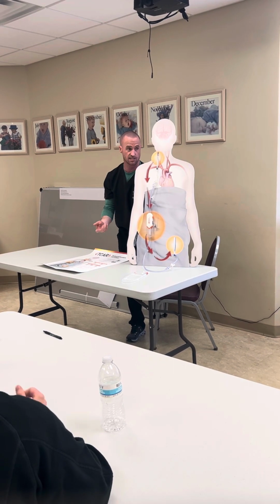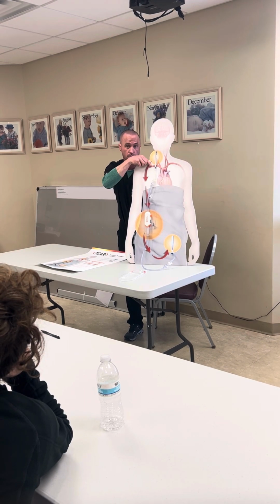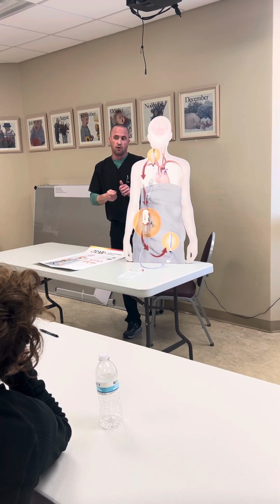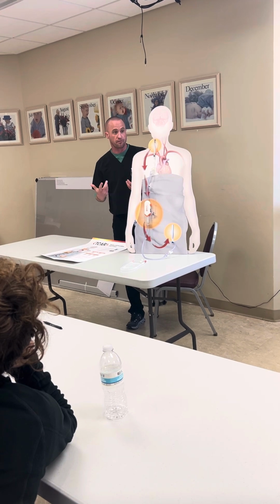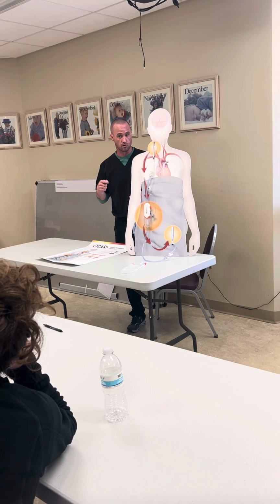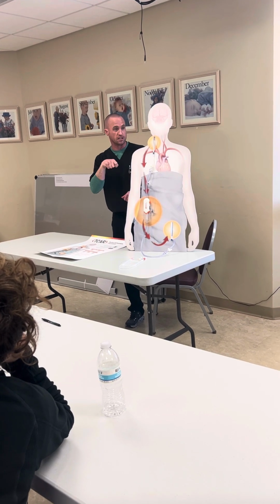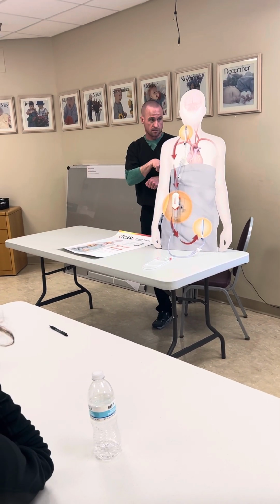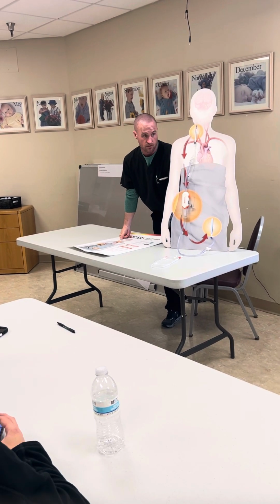So access, in my opinion, is the hardest part of this. Truthfully, it's getting that sheath in the carotid. Some people like to come in real steep. Some people don't have great counter traction on their carotids. Dr. Reiser uses umbilical tape, which I think is probably the best. We don't recommend anything differently, but some people like to use vessel loops. And when they're putting the sheath in, the carotid already kind of moves with the sheath, right? Whereas with an umbilical tape, you get that 1-to-1 counter traction. It's nice. Sheath goes right in. But that's it. That's the hardest part, in my opinion.